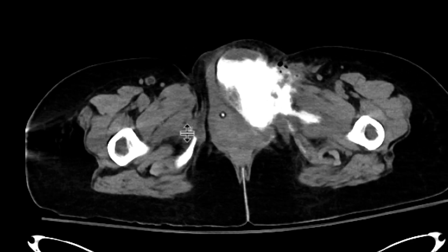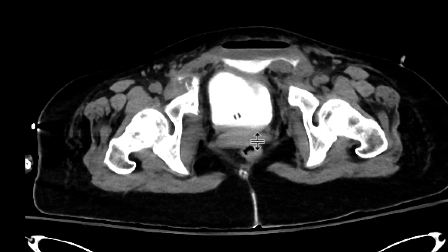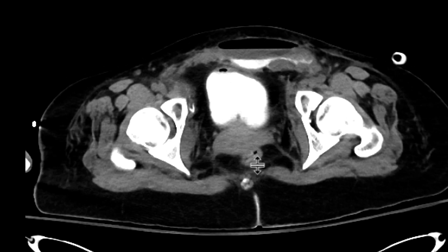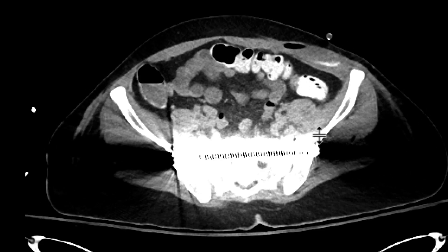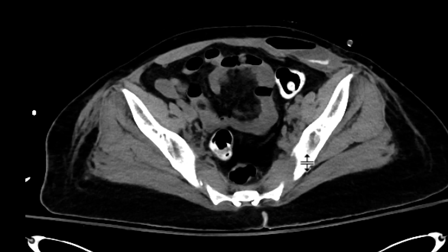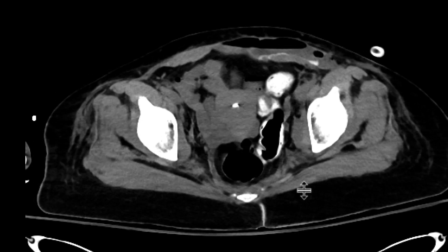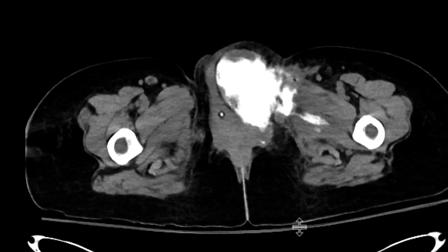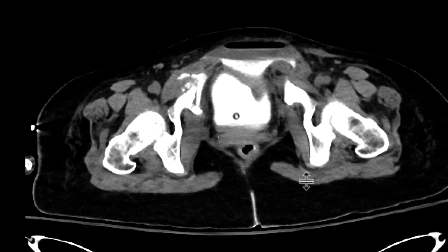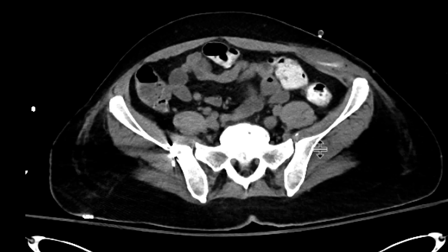The contrast is certainly going inferiorly to the labia on the left side and to the proximal soft tissues of the left thigh, but also extending cephalad and dissecting into the left anterior abdominal wall — we can see some contrast layering over there. This is quite a pronounced extraperitoneal bladder rupture, with all the contrast and urine going to the extraperitoneal spaces. We don't see any of that contrast extending into the intraperitoneal spaces of the pelvis.